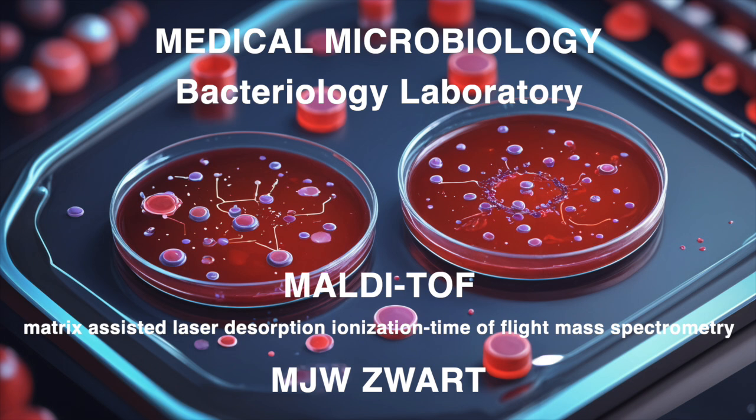All right, let's make these last few rapid fire. Question 6. True or false? The direct method of sample preparation is suitable for all microorganisms. False. Some microbes need that extra help from the extraction method. You're right. Question 7. What should you do if the daily validation with the BTS fails on the first attempt? Repeat the validation with a fresh spot of BTS, then troubleshoot further if necessary.